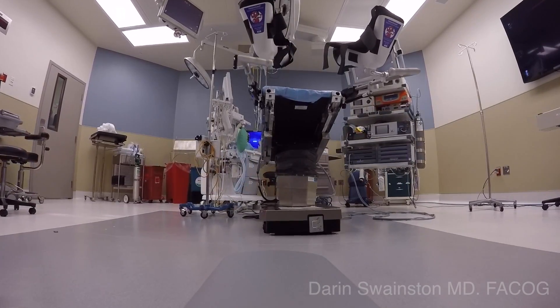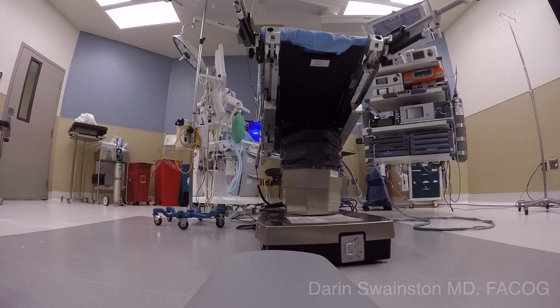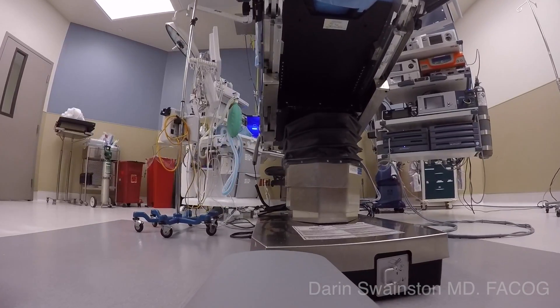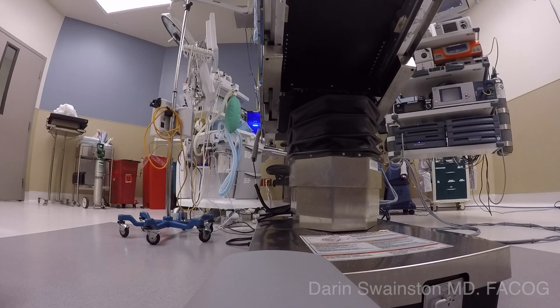The OR staff appreciate a docking technique that is easy to train and reproducible. This technique is neither center docking nor parallel docking — it is in fact a hybrid: a parallel center dock. It is the best of both worlds.